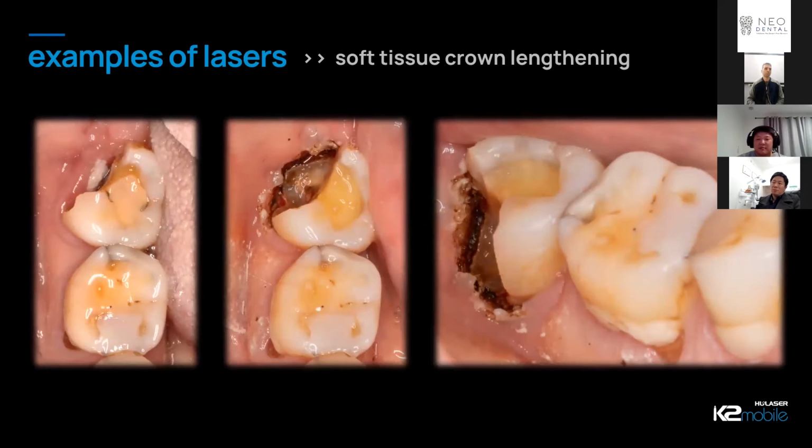And this is probably the most satisfying use of the laser so far. This is a root canal treated tooth, but she's shaved off that distobuccal cusp. But I was able to expose the margin completely, place Tofflemire and sectional matrices, and we could actually restore this somewhat. She knows that the tooth is not in great shape.